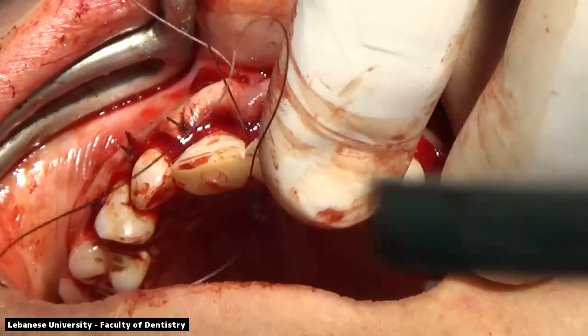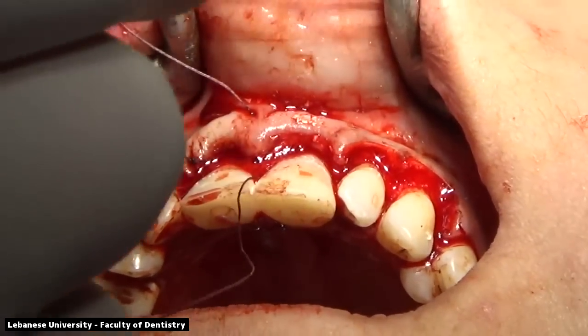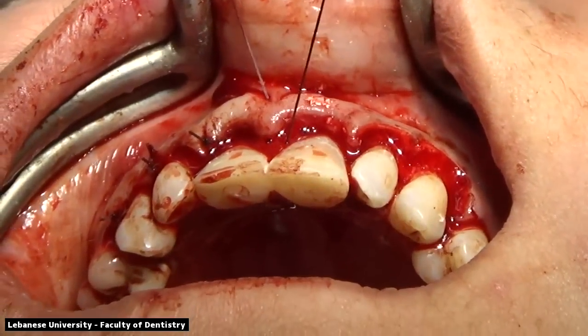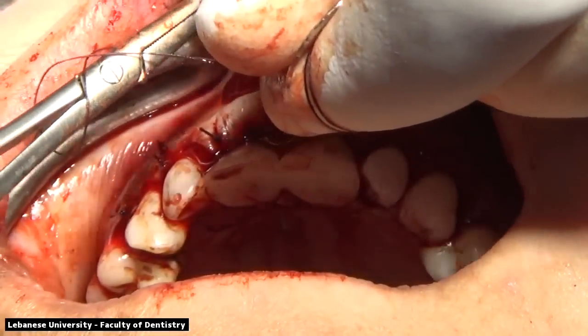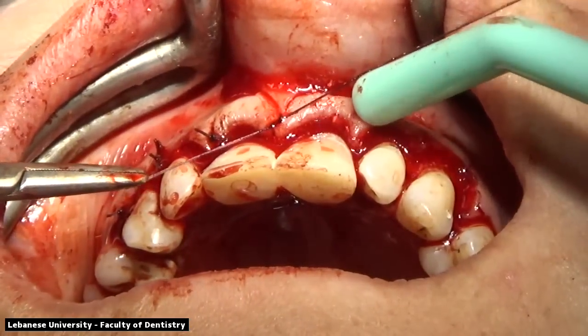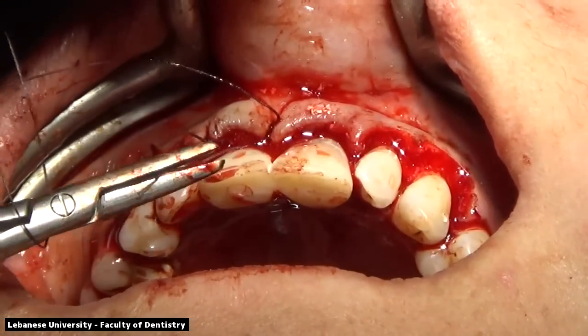And in these cases, you would want to use a wide needle curvature, because if it was a short needle curvature, it would have been difficult to insert underneath the contact areas and go all the way from the buccal to the palatal aspect. The knot is always done on the buccal area, not on the tip of the papilla, but on the buccal portion.